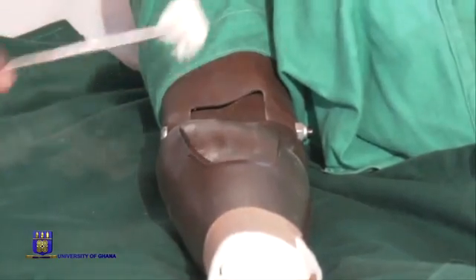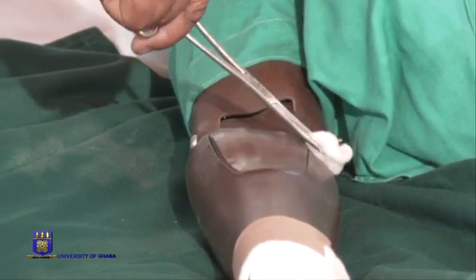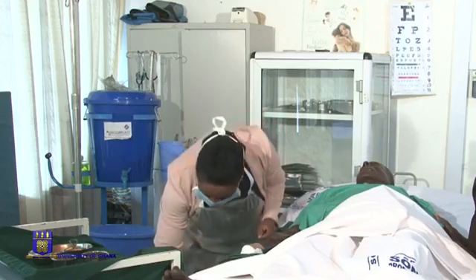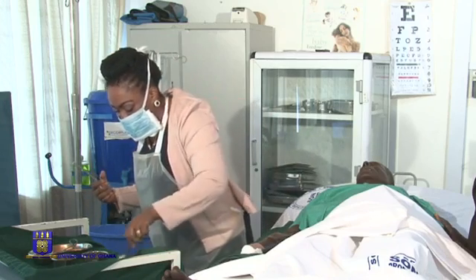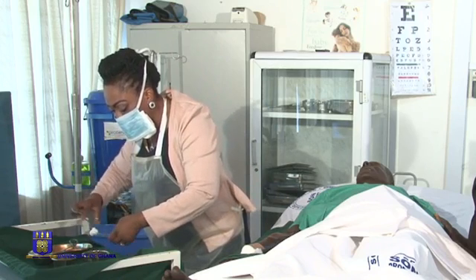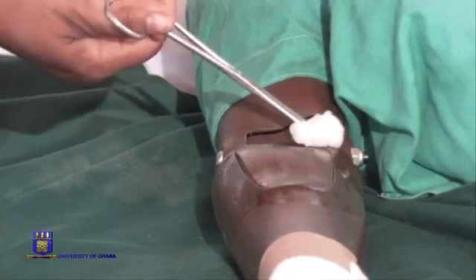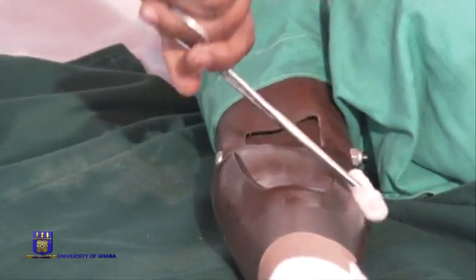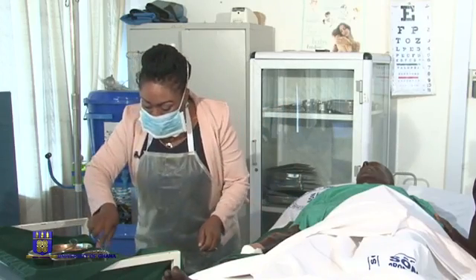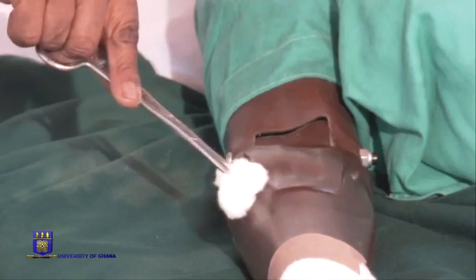Okay, so now that we are done with the inside of the wound, we now come to the outside. We clean the surrounding areas in the same fashion as we did. The wound itself is not dried, but because we are going to apply adhesive tape or bandage, the surrounding is dried after cleaning. So the surrounding area of the wound can now be dried.